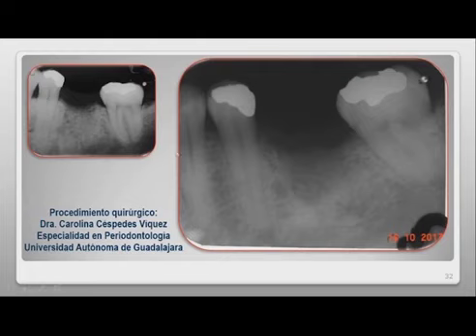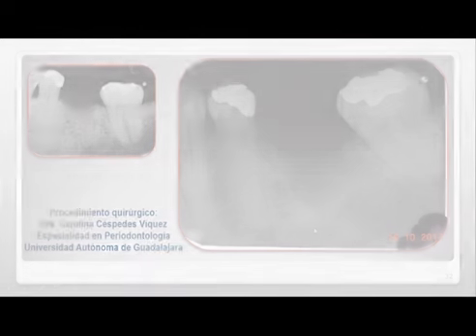Just 2 months later, we can see a little more. At 2.5 months, we can still see some remnants of material in the bottom of the alveolus. And here it appears that the material is disappearing. We believe, and we will see evidence further on, that it does not disappear. It is being replaced, and yet it is still early for healing.